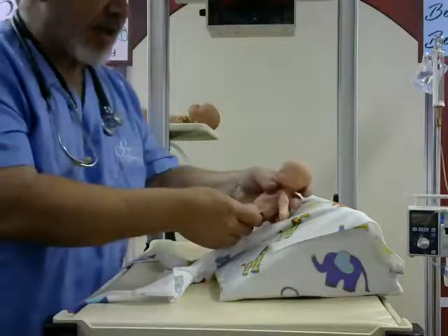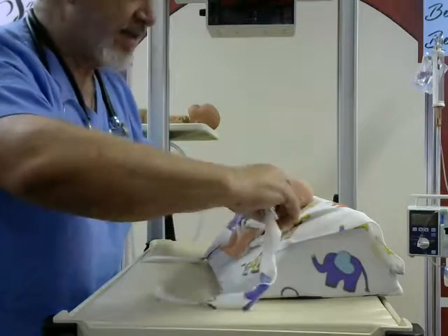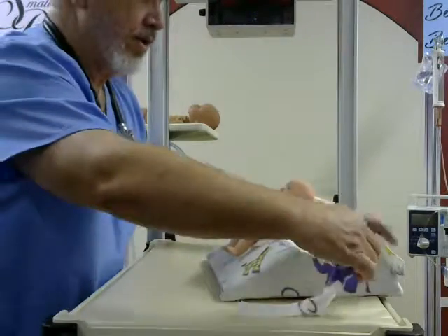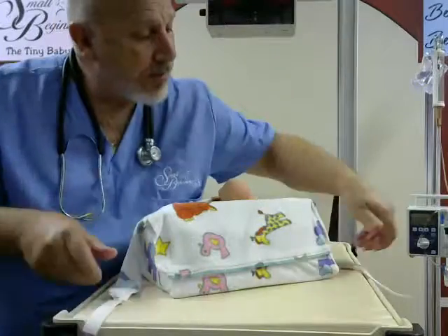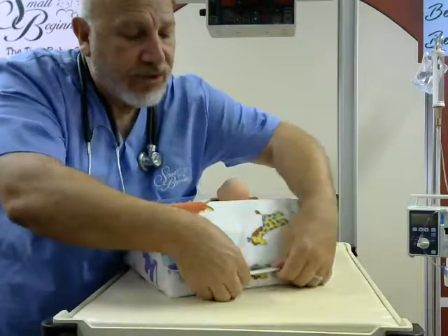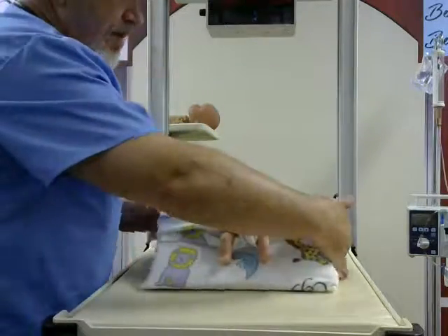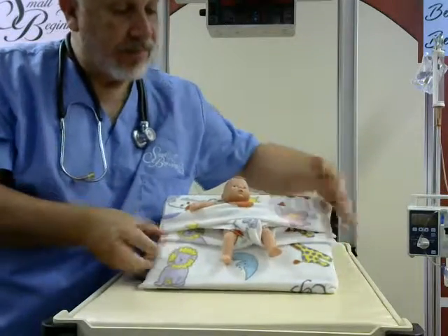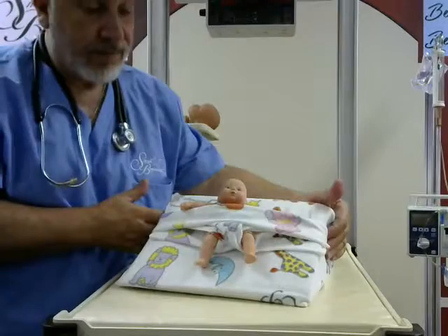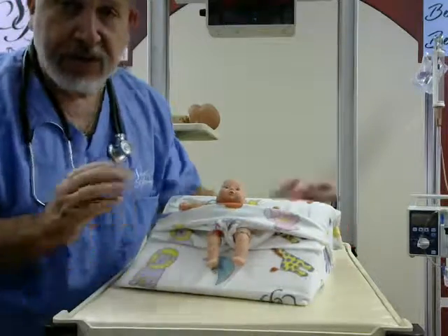We're going to take our micro-preemie baby and place them right in here like this. Because we don't want to cover the baby's face, you can actually flip this over so that it securely fits underneath the shoulders, like so. Then you just come around to the back. Once your velcro is in place, slide it underneath gently. Turn your baby around and your baby's ready to go — nice and comfortable and stable. And because of that twisting, you can keep the crotch nice and narrow so your baby's legs aren't forced out.